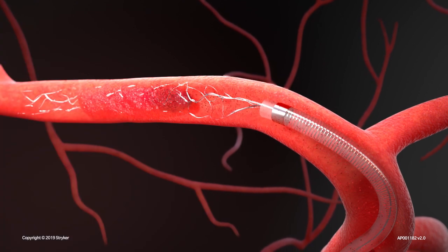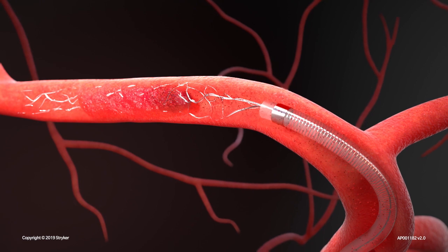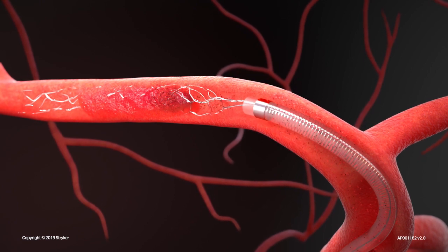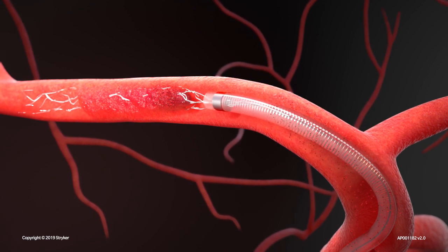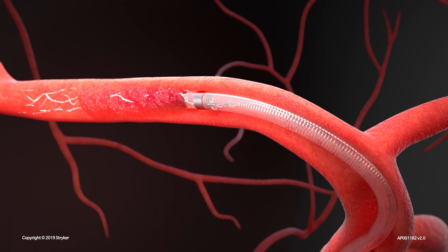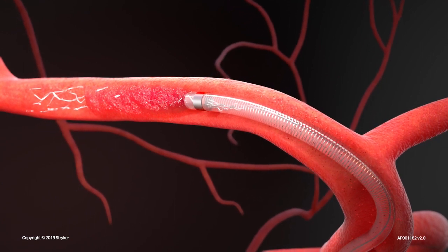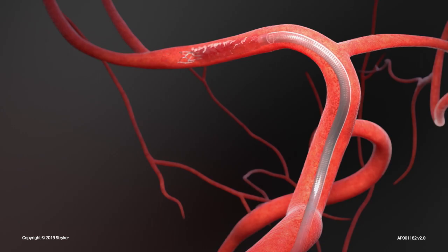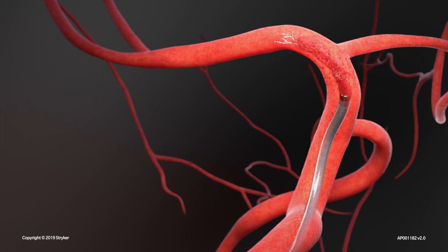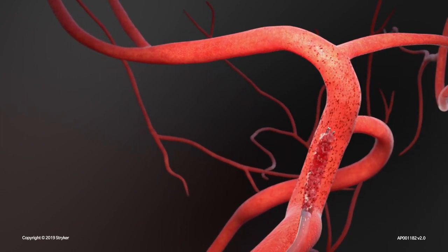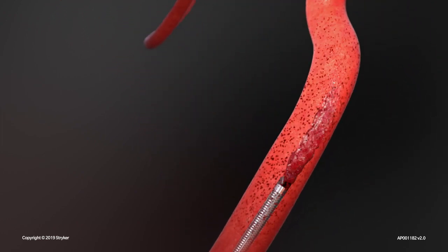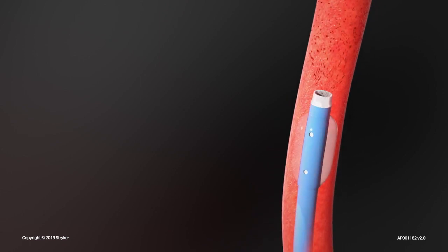Once blood is seen through the tubing, advance the access catalyst distal access catheter towards the clot to ingest and control the proximal face of the clot. Observe flow stasis through the aspiration tubing to ensure clot engagement. The retriever and distal access catheter are then pulled together as a unit while aspirating through the access catalyst distal access catheter and balloon guide catheter.